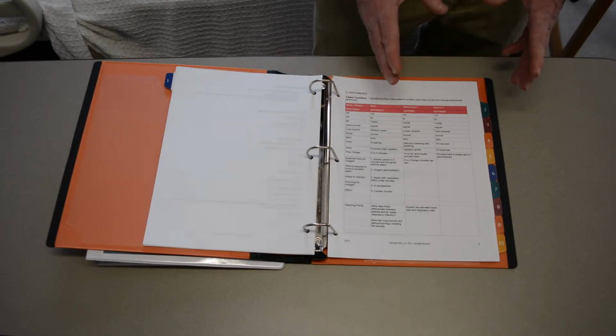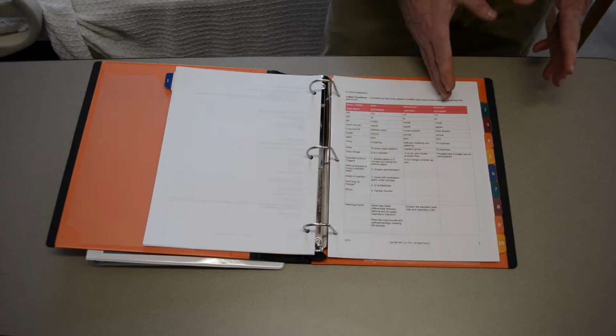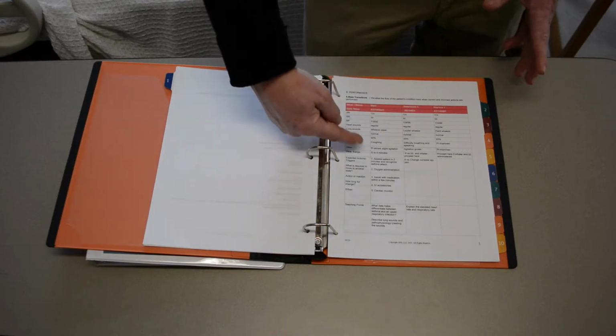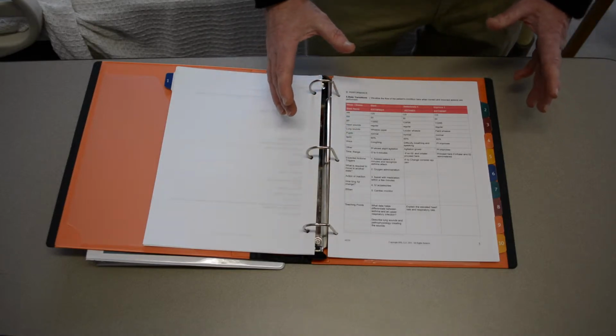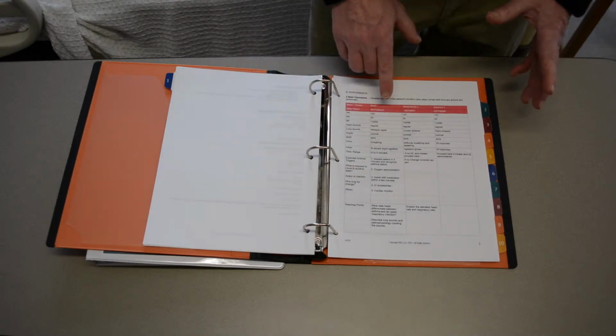All scenarios have a start state, a deteriorate state, and an improvement state. Some scenarios may have several deterioration states. Within each state, all the physiological parameters such as heart rate, respiration, and blood pressure are laid out. When you are running the scenarios, pressing one button in the software will apply all the physiology at one time.